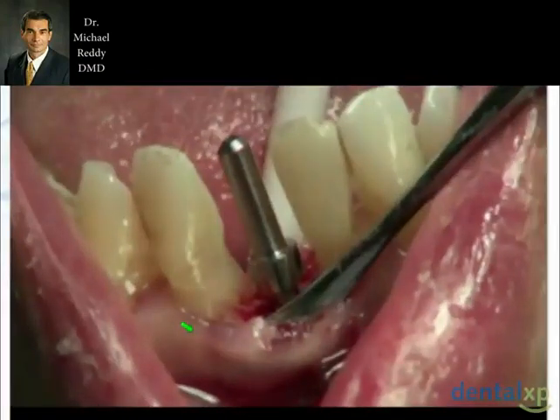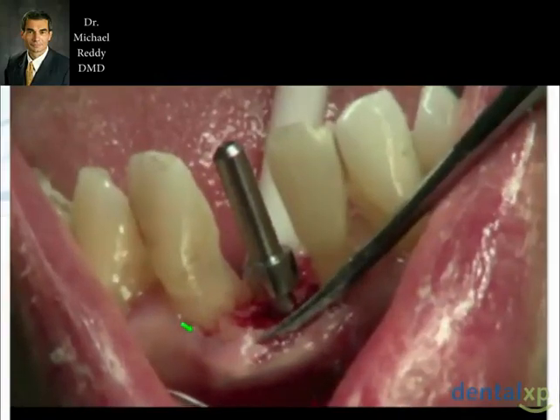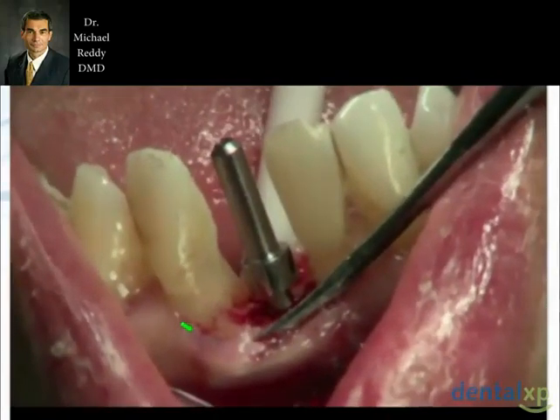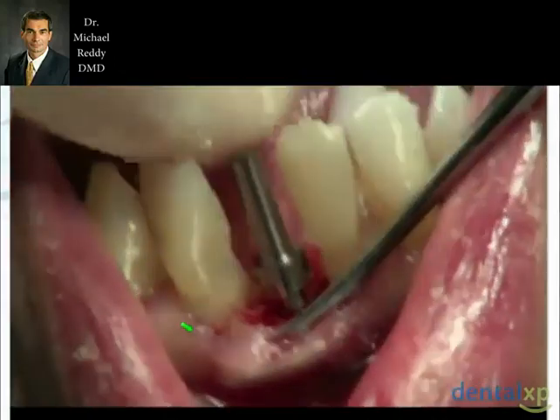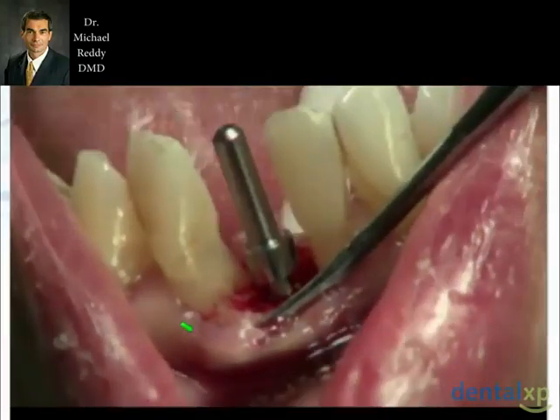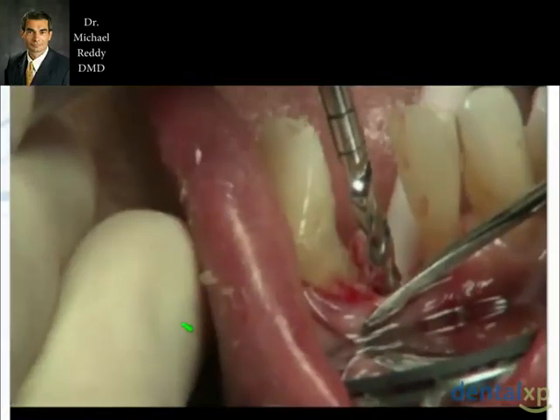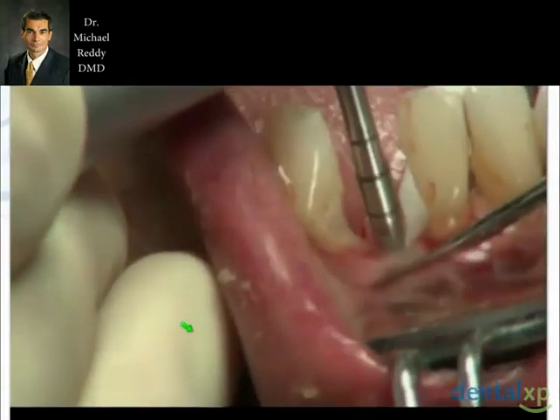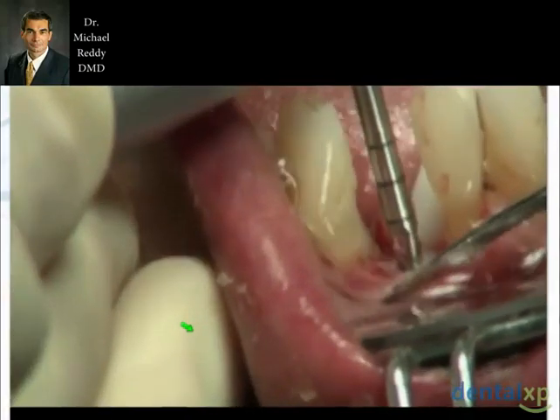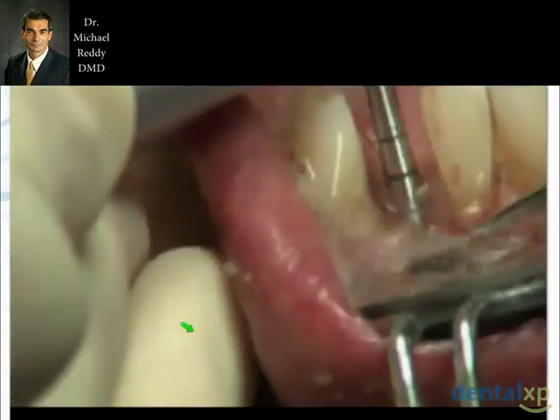The second step we said was putting in one of these parallel pins, looking at the adjacent anatomy, looking at the space in between the teeth, maybe taking an intraoperative radiograph right now, looking at the position of where we are in reference to the adjacent roots. Then moving to the 2.5. Now, you can see this is only going from 2 to 2.5, so this cuts very quickly.